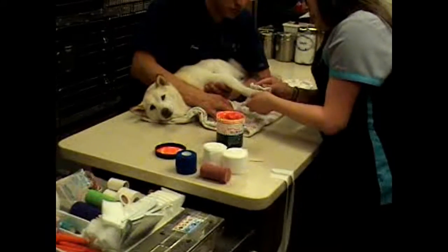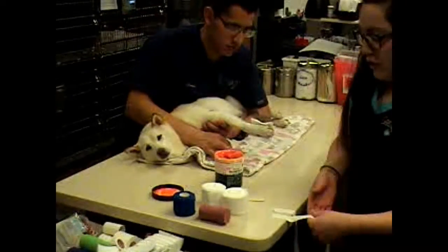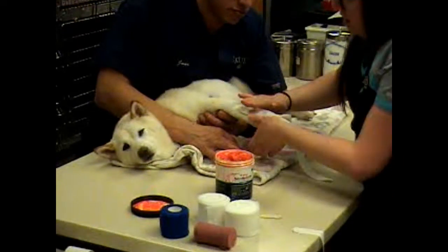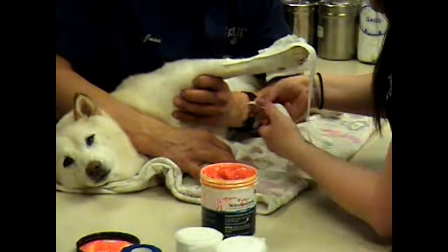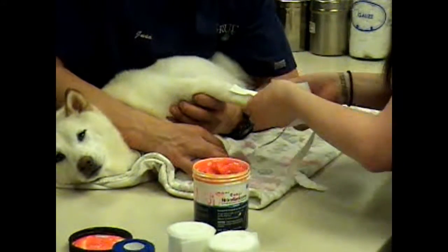We'll just apply this right to the bottom here. Juan's holding the arm extended for me while I place the stirrups, just to help keep the bandage up. It's going on each medial and lateral side of this limb as best as I can with the 3x3s — with the little red wonder.